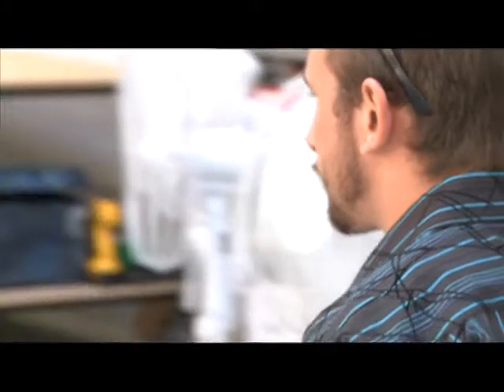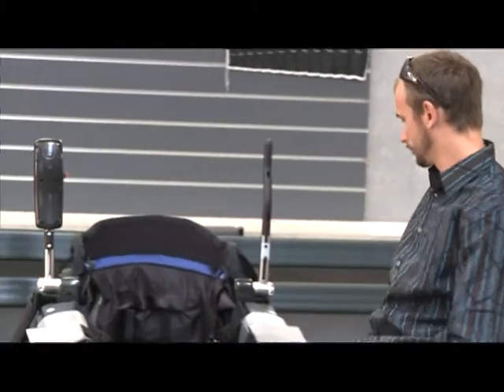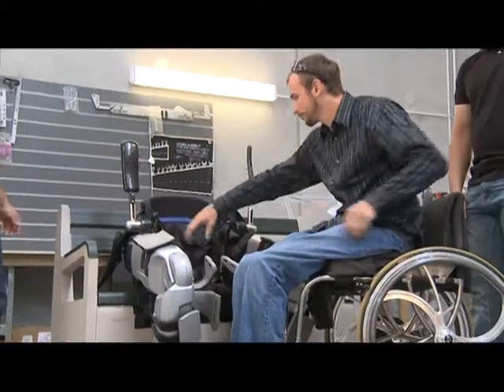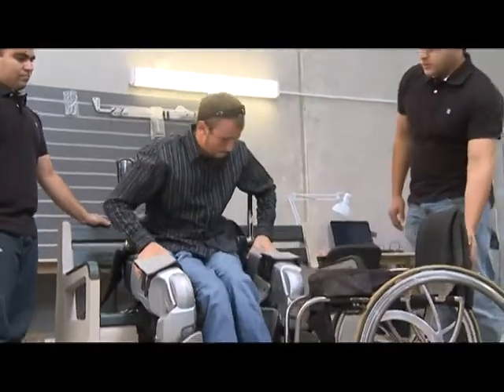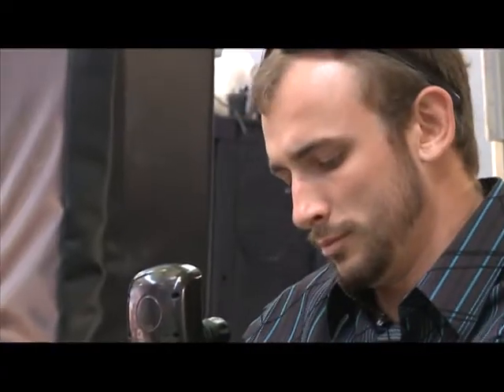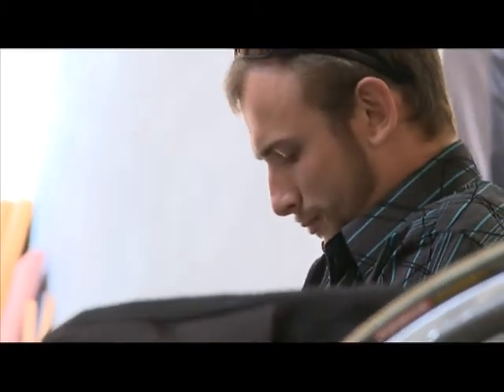Generally when I get into the Rex, I'll wheel my wheelchair so it's at a 90 degree angle with the machine, then I make sure all the straps are clear so I'm not sitting on any buckles — obviously that makes it difficult to do them up. I self-transfer by holding onto the legs of Rex and just lift myself across, get my own legs sitting in the cuffs, and from there it's about five minutes all up to get yourself strapped up and ready to go.